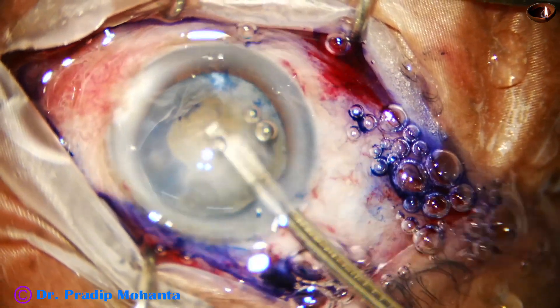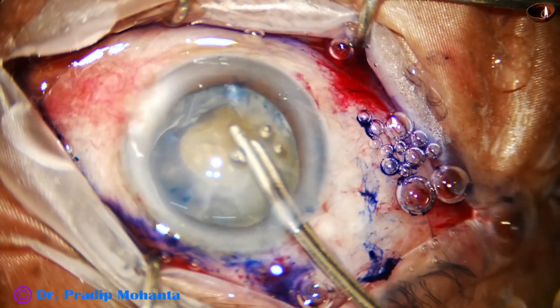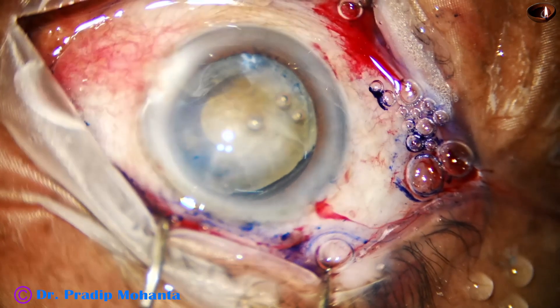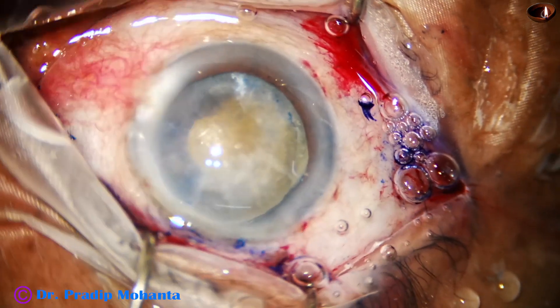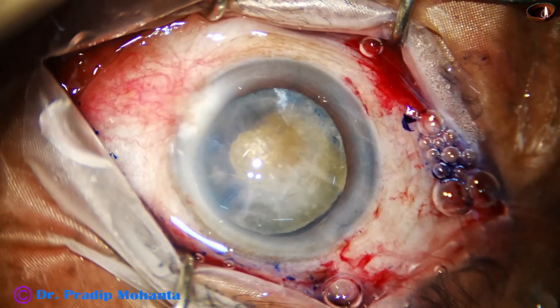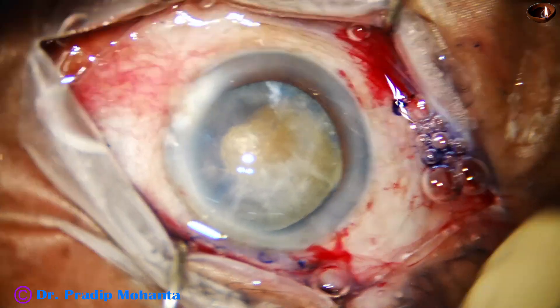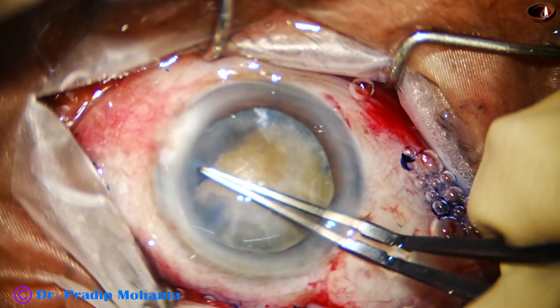I wash the dye. This area is not taking a stain. So what to do? I inject visco and take a Vannas scissor to make an incision, because the rhexis is so small I cannot proceed. I have to enlarge the rhexis, but I cannot enlarge on the side of zonular adhesions — I have to enlarge where the zonule is attached.